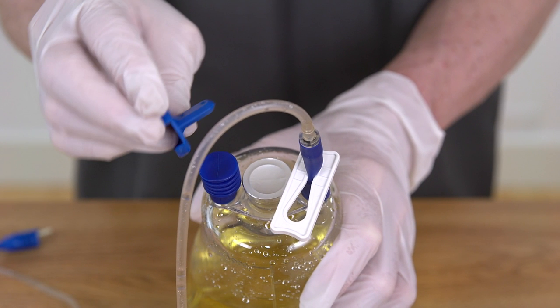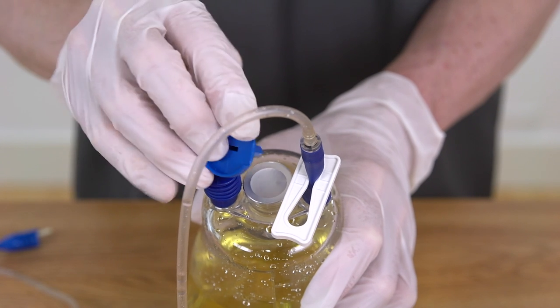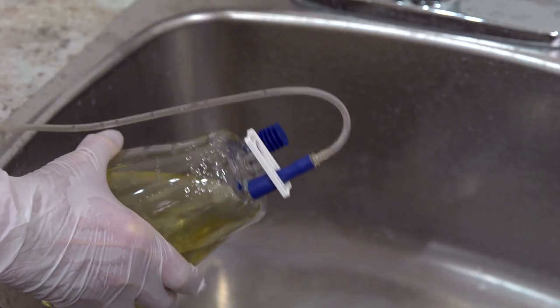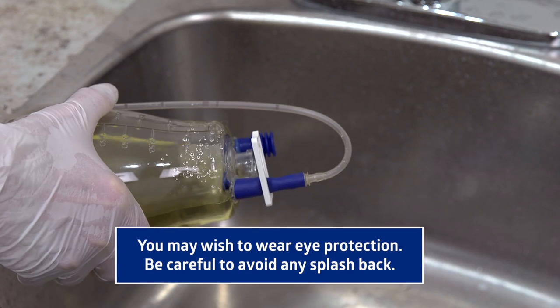Hold the bottle away from your face. Using the extended top of the cap, gently puncture the foil seal over the drain hole. You may now pour the contents into a toilet or drain if your practice directs this disposal method. You may wish to wear eye protection. Be careful to avoid any splash back.